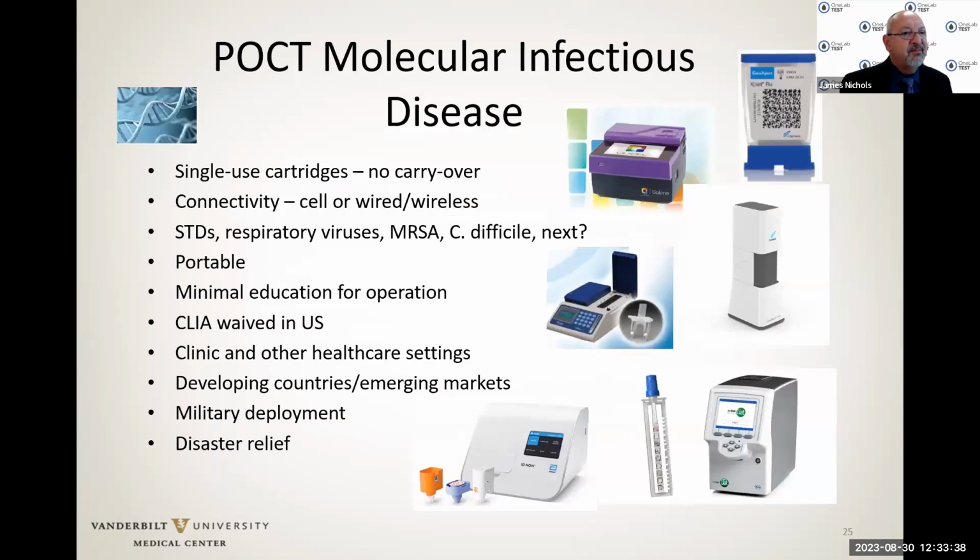Let me talk about pandemic. And this was the first time that we started actually implementing point of care molecular infectious disease testing. These devices have single-use cartridges. They minimize the potential for carryover. They're connected, wired or wireless. They test for a variety of different organisms. Primarily during the pandemic, it was COVID and respiratory, influenza A and B, RSV.